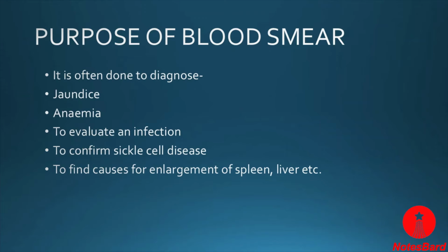And with low blood platelet counts in our body, it is used to determine if the cause is increased degradation or decreased production, based on the size of the platelets. So these are some reasons and purposes for any doctor to perform the blood smear test.